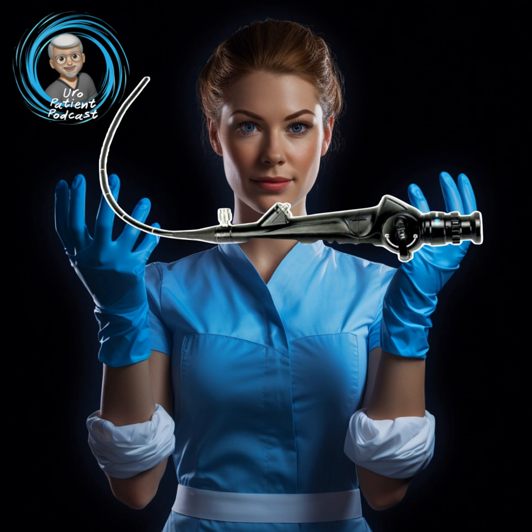Over here, this is looking through the urethra at a man's prostate — those are the lobes of the prostate. Sometimes we refer to this as kissing lobes, as you see they kind of meet together. And when we talk about an obstructing prostate, that's what we mean.